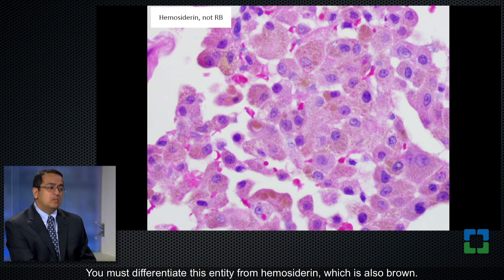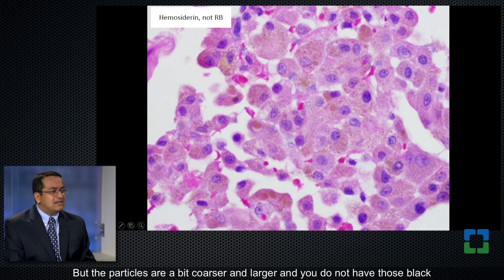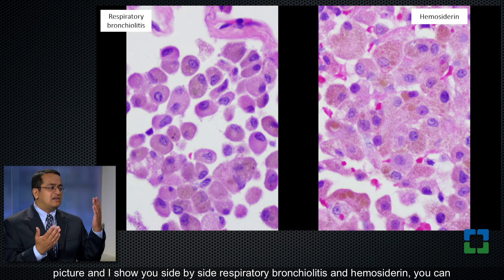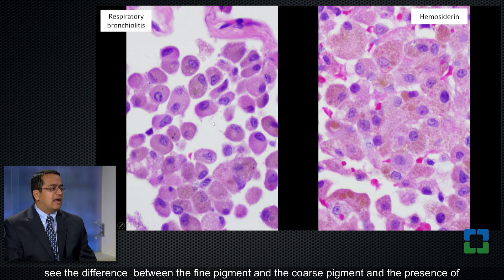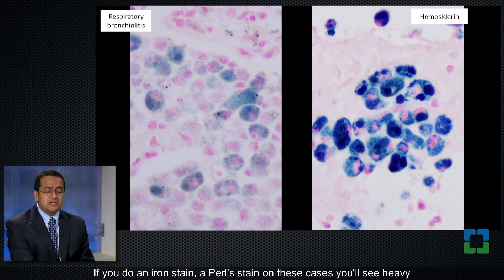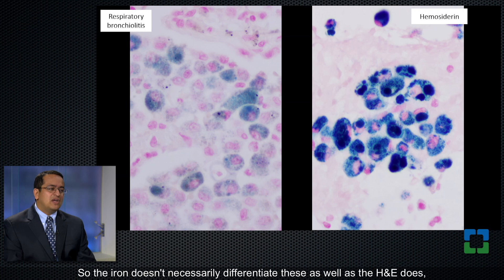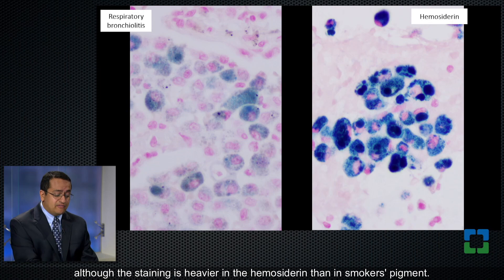You must differentiate this entity from hemosiderin, which is also brown. In hemosiderin, the macrophages are filled with a brown pigment, but the particles are a bit coarser and larger, and you do not have those black specks seen in respiratory bronchiolitis. Showing them side by side, you can see the difference between the fine pigment and the coarse pigment, and the presence versus absence of black spots. If you do an iron stain — a Perls stain — you'll see heavy iron-positive staining in the hemosiderin, as expected. But interestingly, cigarette smoke pigment is also lightly iron positive, so iron doesn't necessarily differentiate these as well as the H&E does, although the staining is heavier in hemosiderin than in smoker's pigment.